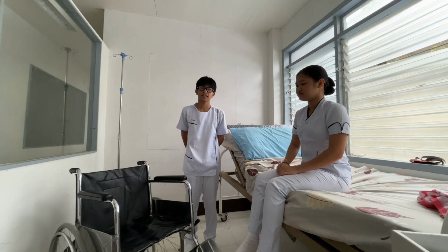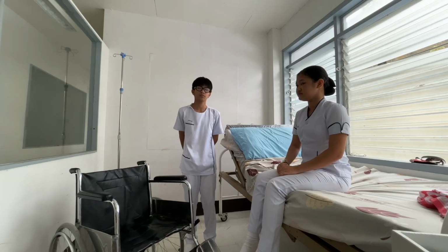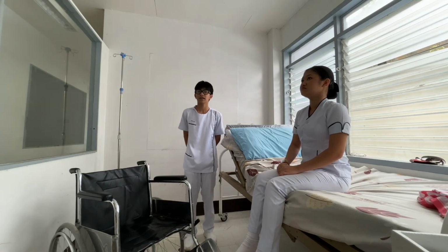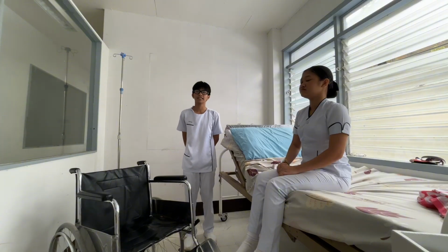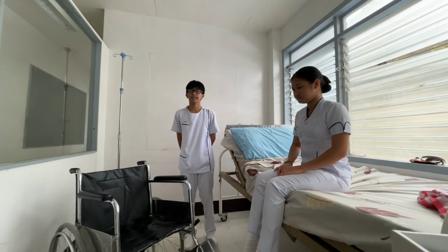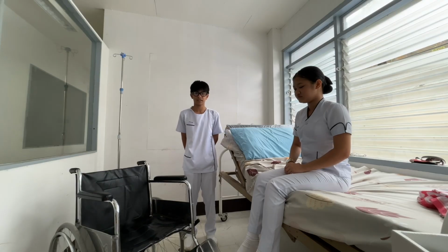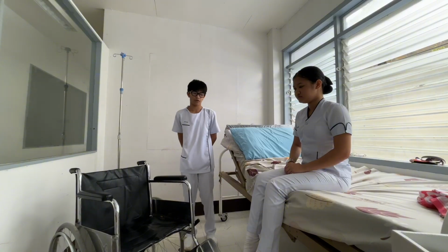Apply the gait belt snugly around the waist, only if required for the patient. Check to be certain that the belt is securely fastened and place the hands on the waist to assist into a standing position. Then, as the patient leans forward, grasp the gait belt on the side of the patient. Let the patient hold your side with your arms outside the patient's arms. Position your legs on the outside of the patient's legs and the patient's feet should be flat on the floor.